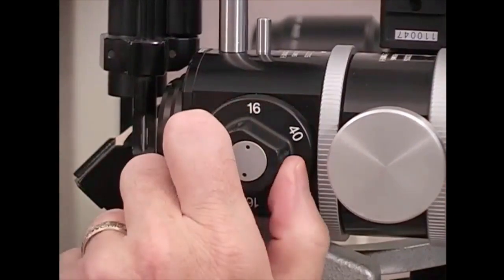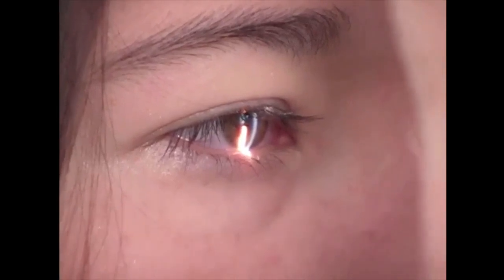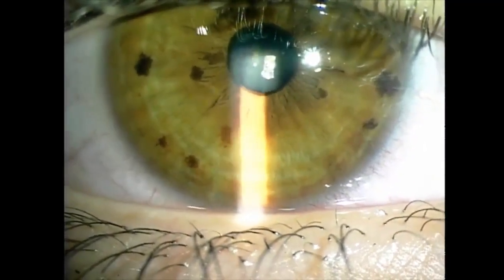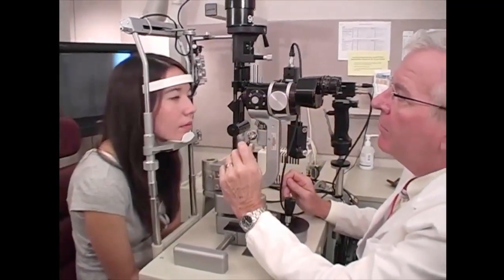I'm going to do the exam mostly at 10 or 16x. I don't need to magnify things too much. And I use a short beam of light. So I want a dark room and a short beam of light, because as light floods the pupil, it opens the angle. And you can see that in this gonio video. I have quite a narrow angle, but as I open the light up and shine it into the pupil, it causes the angle to open. So a short beam of light, dark room. I'm not flooding the eye with light, because that's going to change the anatomy.